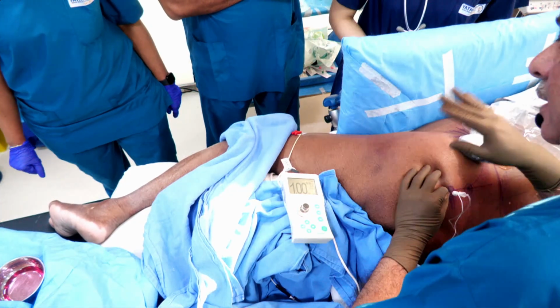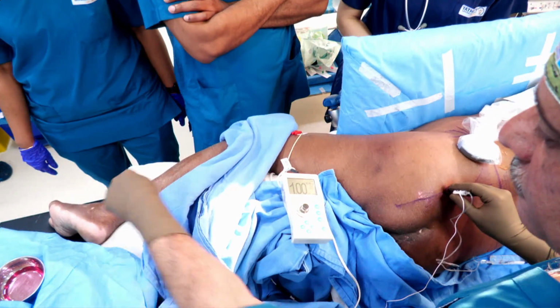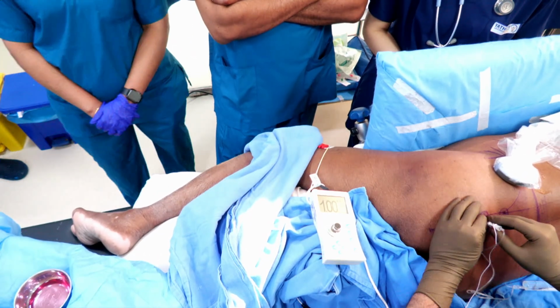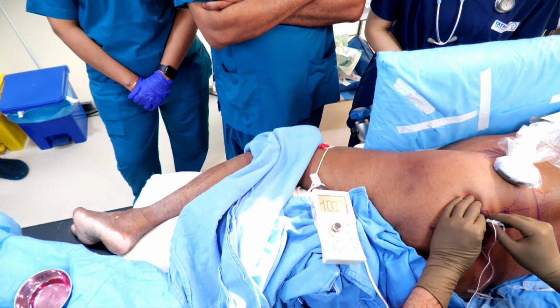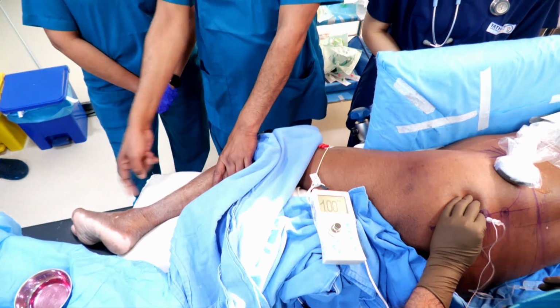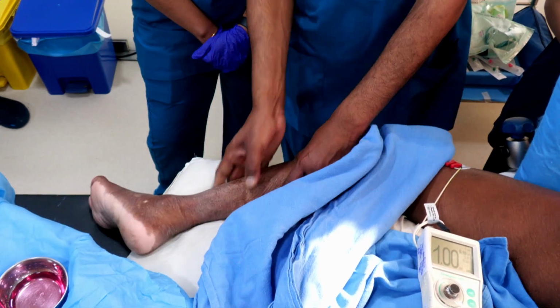You can see that there is inversion or eversion. So you got the hamstrings, but you got the foot also. See, now you get just the hamstring. You get just the gluteal contractions. And when I reposition the needle, then you get the contractions of the calf muscle. I'm going to go a bit more inside, and now you can see the contractions of the toes. Can you see the contractions of the toes, Devesh? Yes, sir, we can appreciate. Yes, so that's the plantar flexion with contractions of the toes.